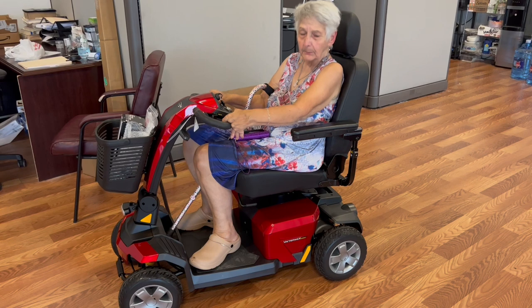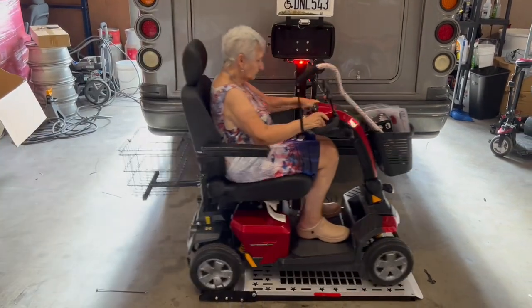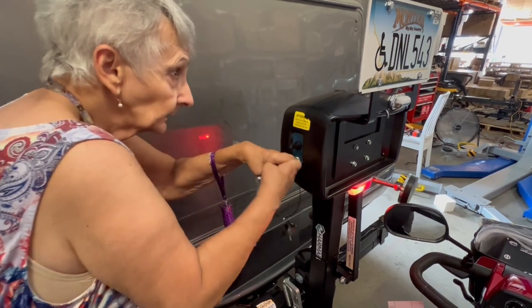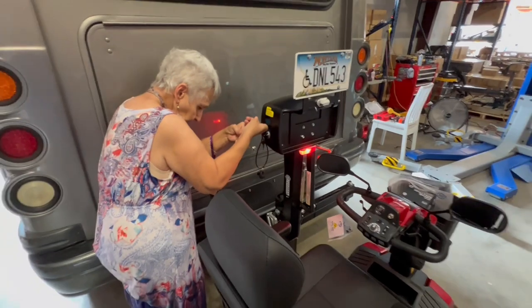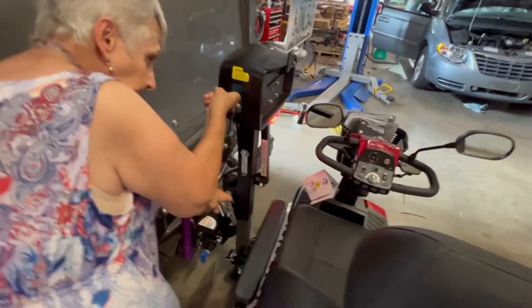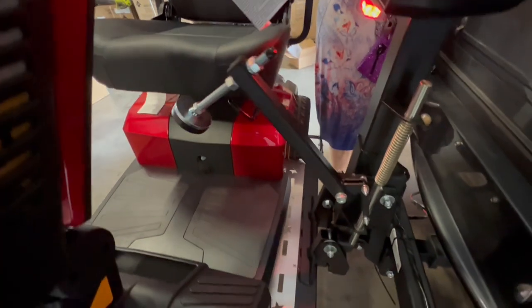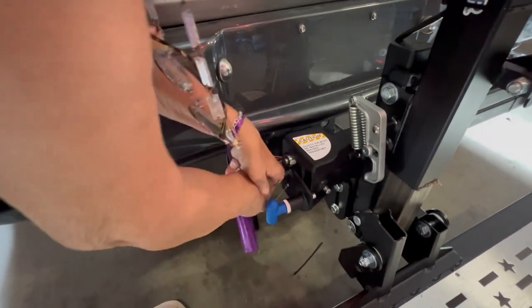I'm at Automobility Scooter Place in Austin, Texas. I put the lift key in and I turn it. Are the lights on now? Yes, ma'am. So I press the button on and hold it. Then show how it's going to lock — can you show how it's locking? Now we're going to push it up so we can show the swing away.